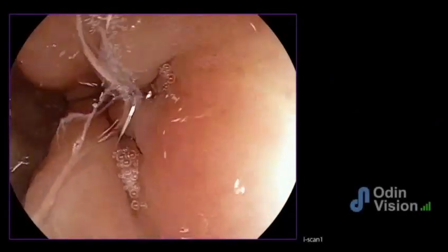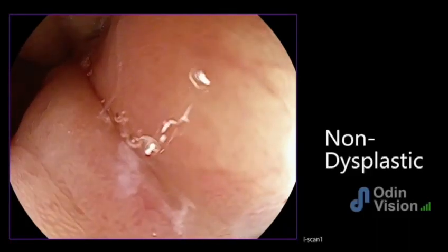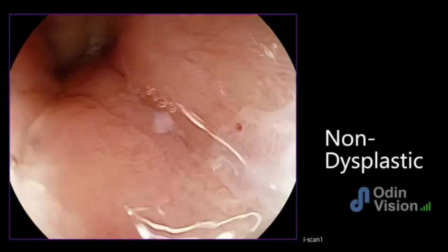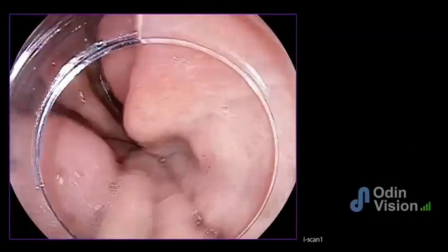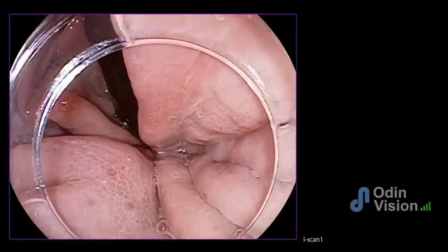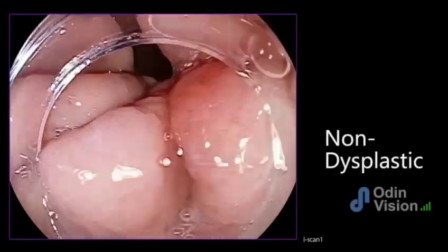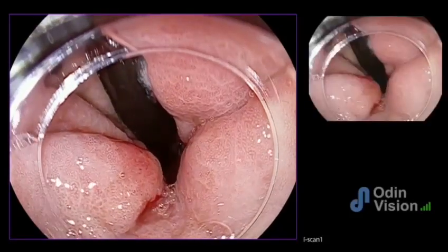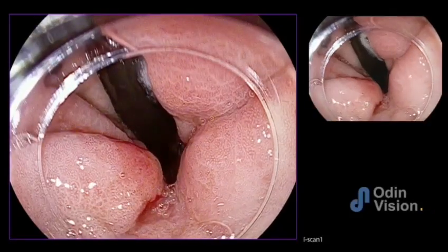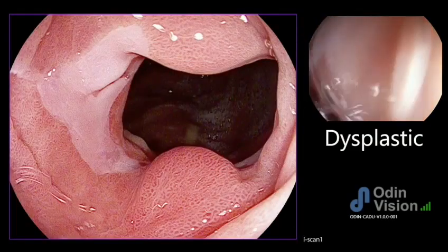Let's look at some normal tissue at the GOJ, which has normal architecture, and make a prediction, and it tells us this is non-dysplastic, and therefore it's making an important differentiation between dysplasia and no dysplasia and is able to detect the difference. And similarly here in retroflexion, we make a prediction and it's non-dysplastic, but when we focus in and look at the nodularity of the GOJ which comes into view and make a prediction now, clicking the pedal, it tells us that it's dysplastic. And it's able to differentiate between the two.